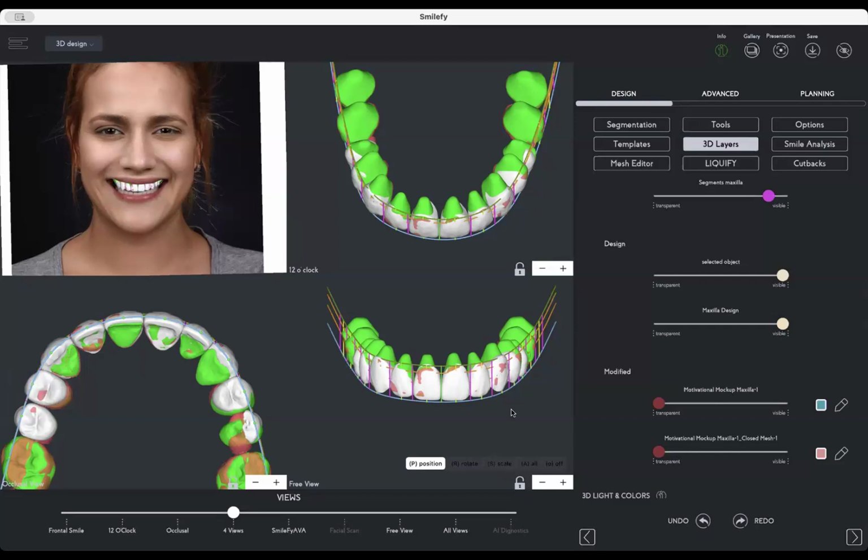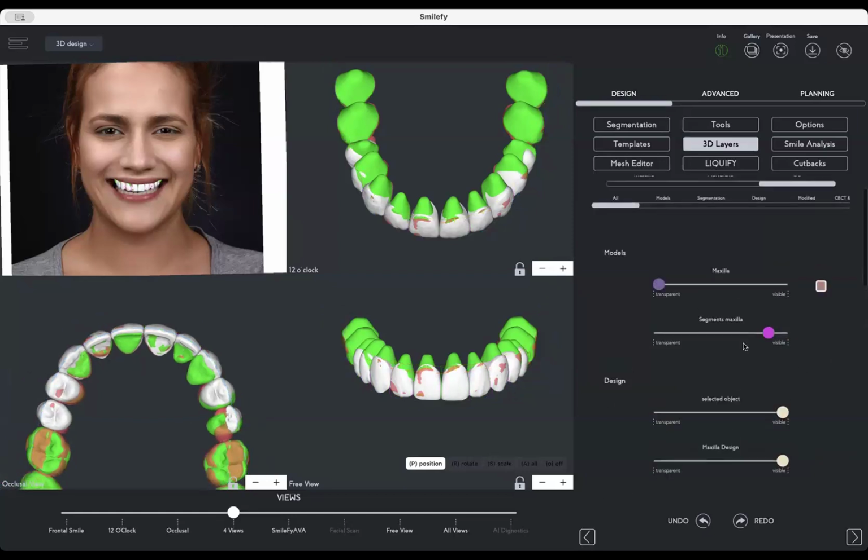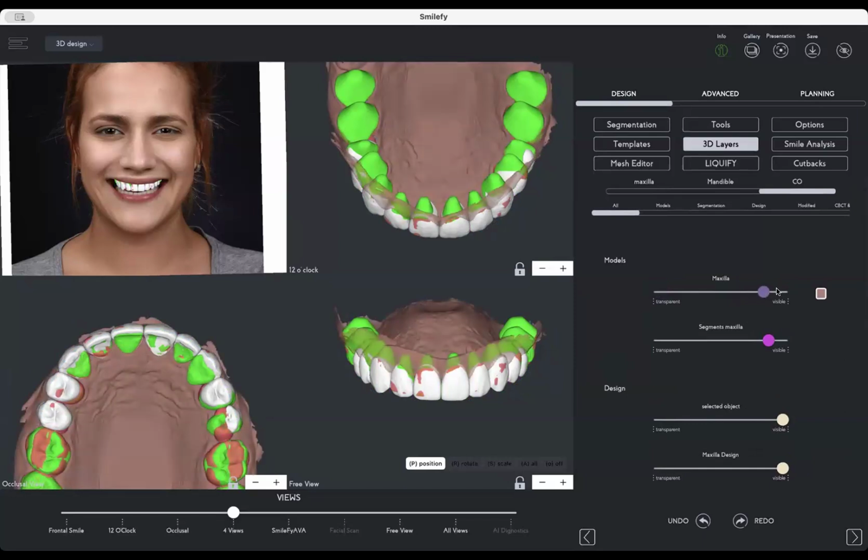Now we have a complete different situation, right? We have the ortho treatment. It's very visual. We can now explain to the patient, look, in order to create a very minimal invasive treatment plan, new design, new veneers, crowns, whatever it will be, we need several steps.